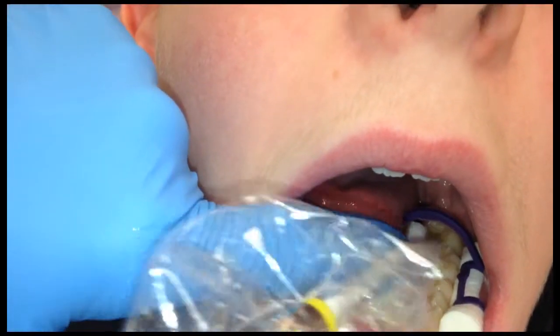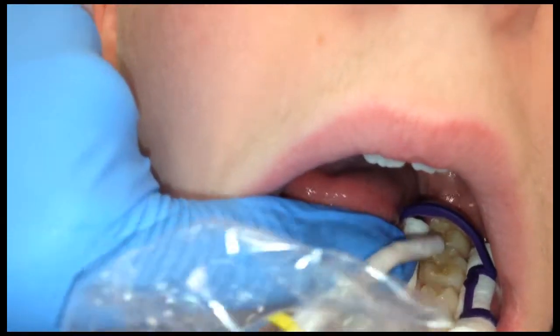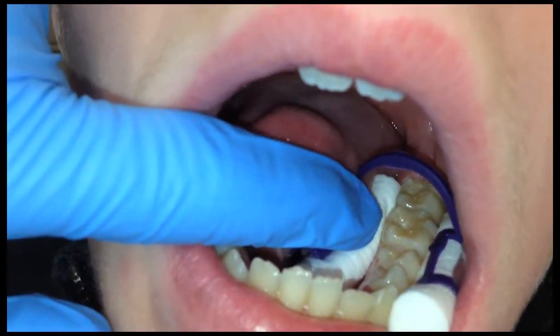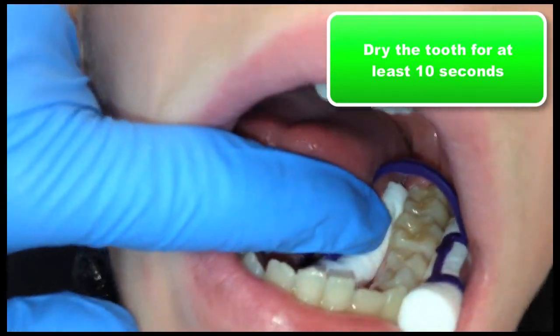Next, dry the tooth thoroughly. This is necessary because if the tooth is not dry, it will interfere with the formation of the enamel tags or micropores that the sealant material will adhere to. Dry the tooth for at least 10 seconds.